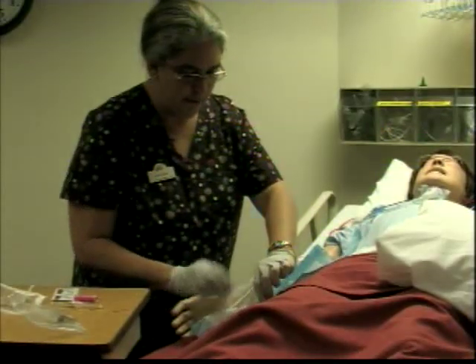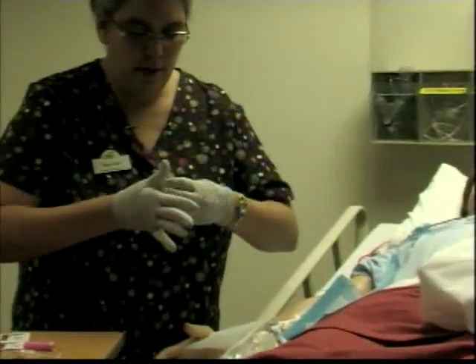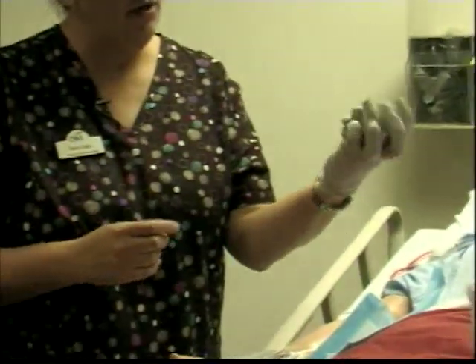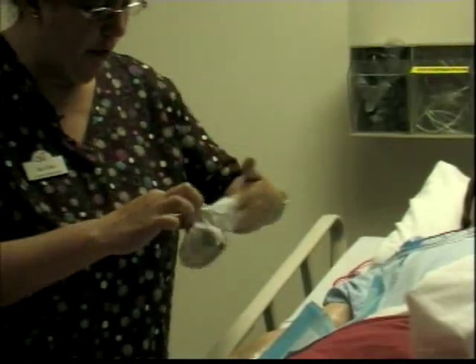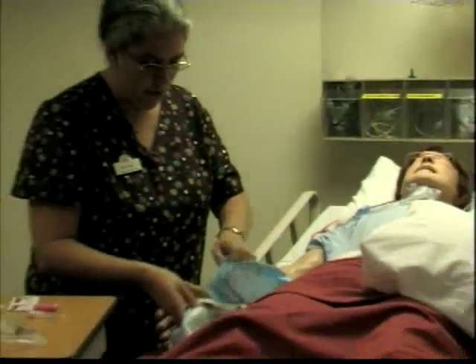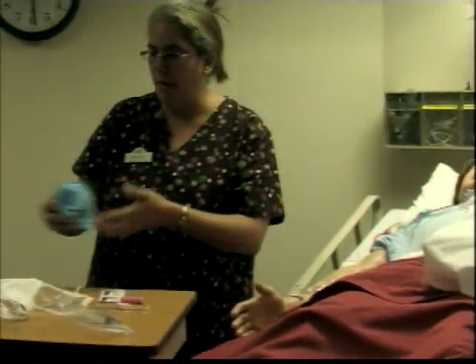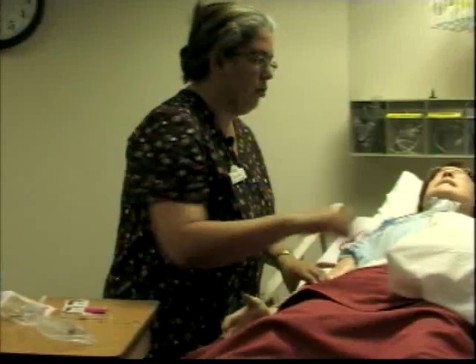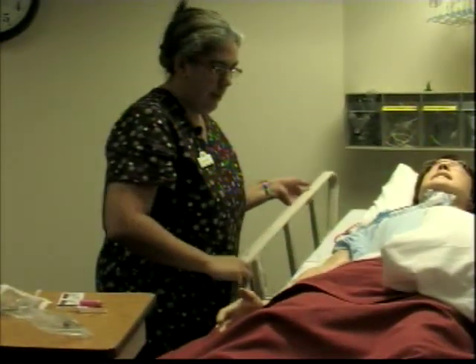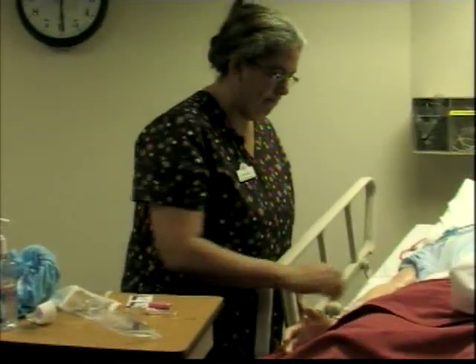Including your gloves. And how do you take your gloves off? You grab it by the middle, make a ball into your other glove, go underneath it, remove them. Make sure you gather everything and put it in the trash bag, the red bag. Okay? And then you are making sure that you leave your client safe, rails up, whole bed down.